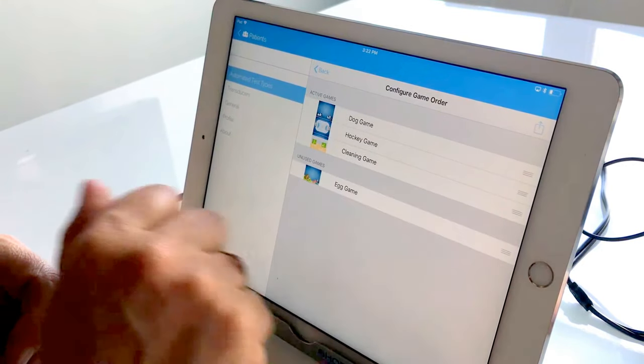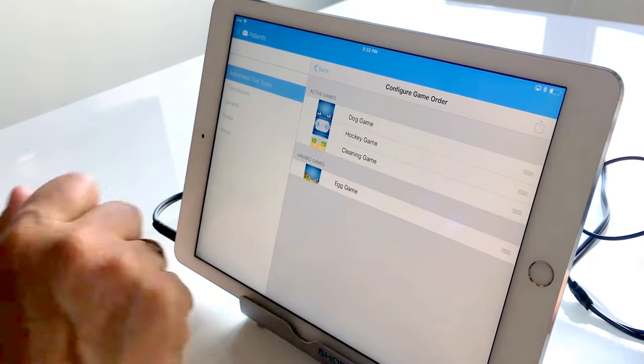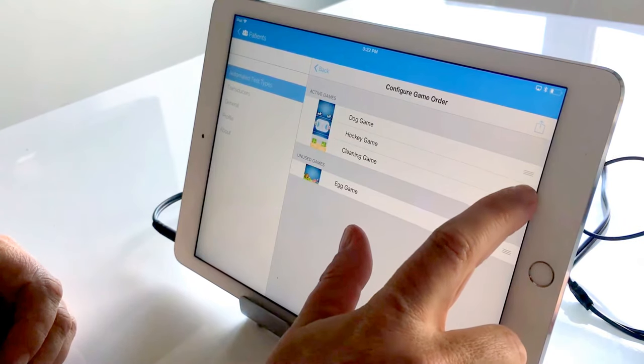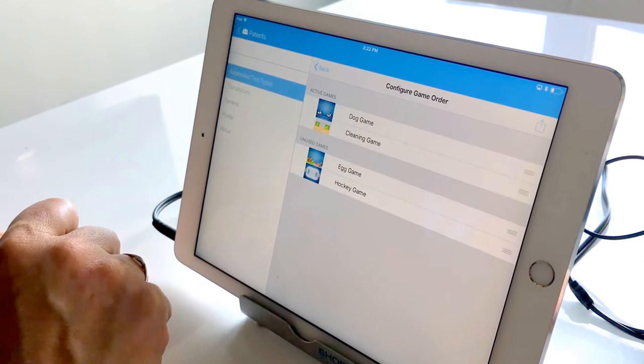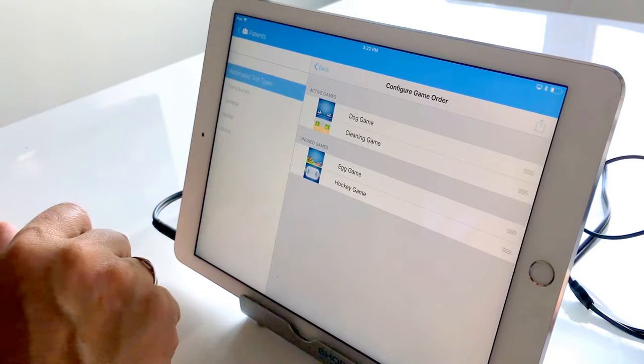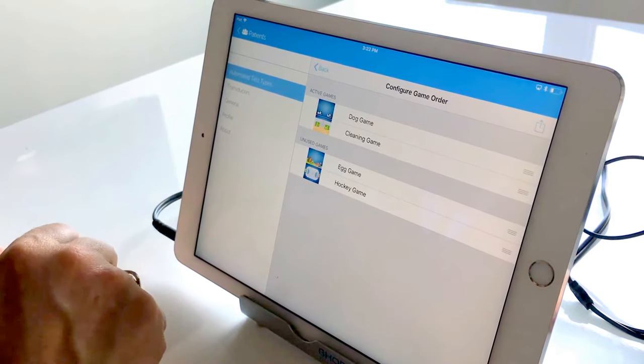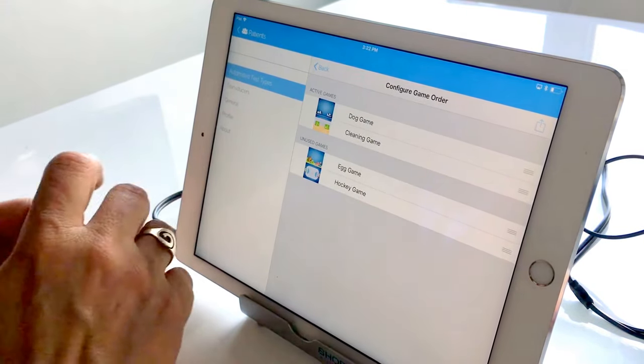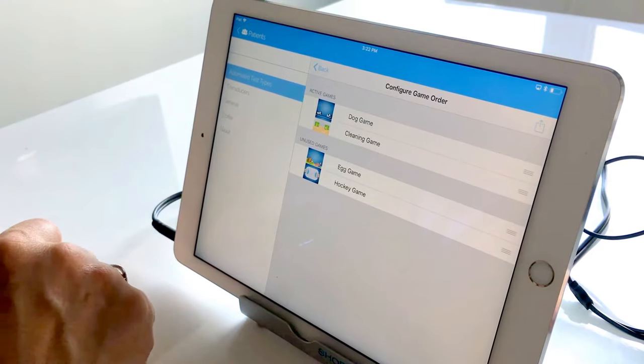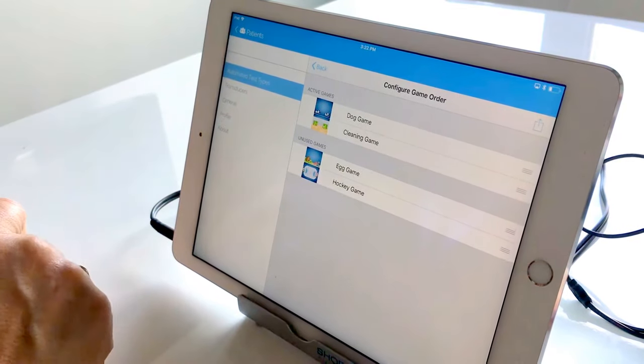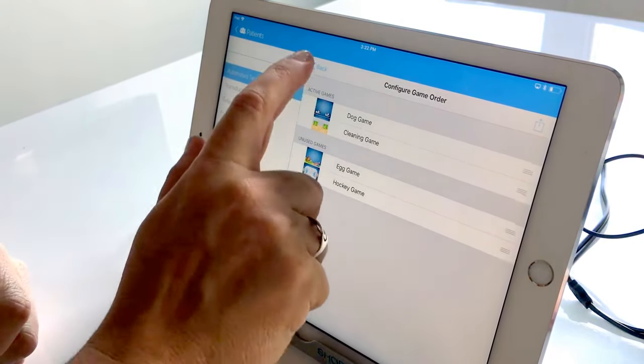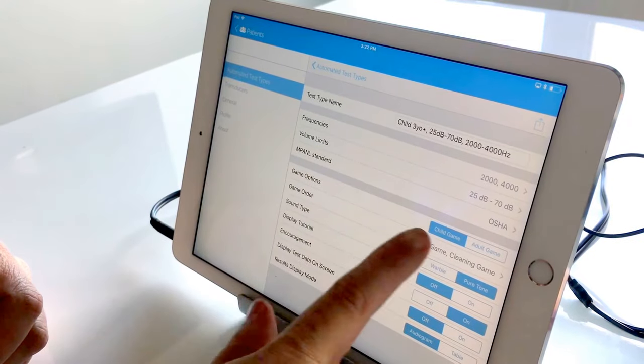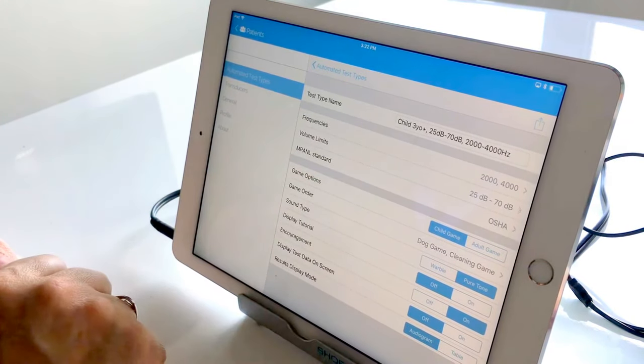I'm gonna go ahead and drag the egg game down and the hockey game down as well because again we're only testing two frequencies so I feel that two games is sufficient and it might help keep the attention of some of the younger children as opposed to providing a higher level of stimulation.